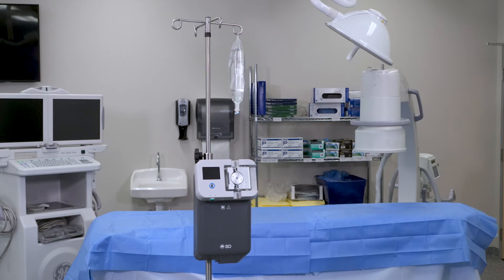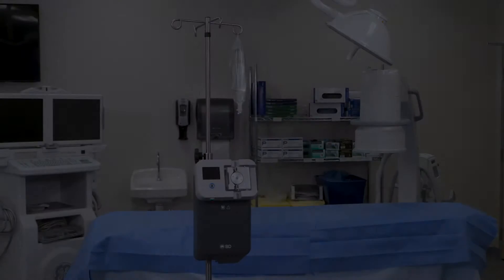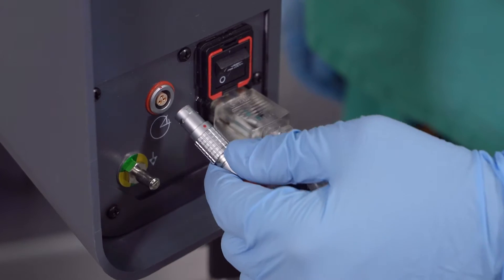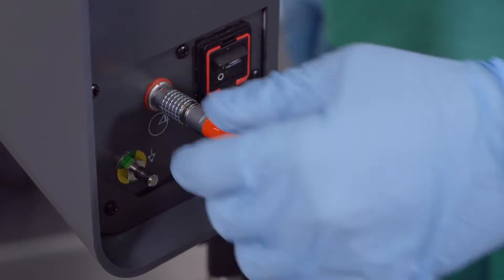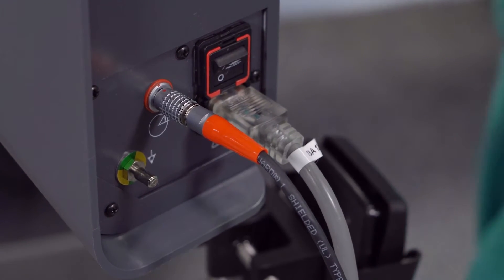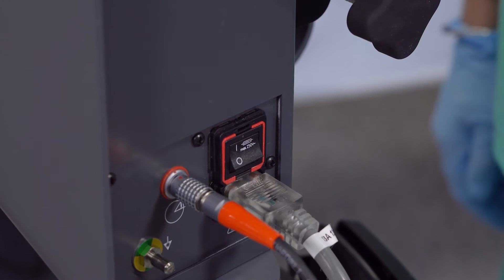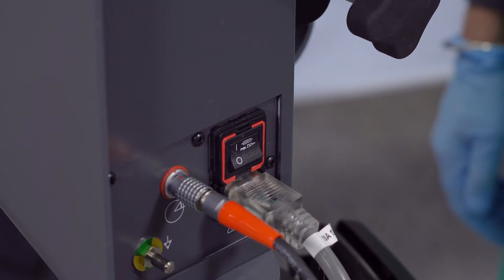Plug in the power cord to the wall power receptacle. Connect the footswitch to the footswitch receptacle denoted by orange markings and ensure that the red dots on the footswitch connector and receptacle are aligned. Then turn ON the console using the switch on the lower right side of the back of the console.